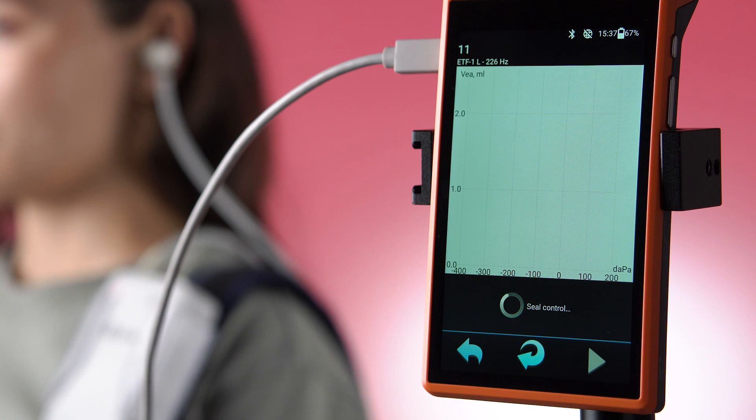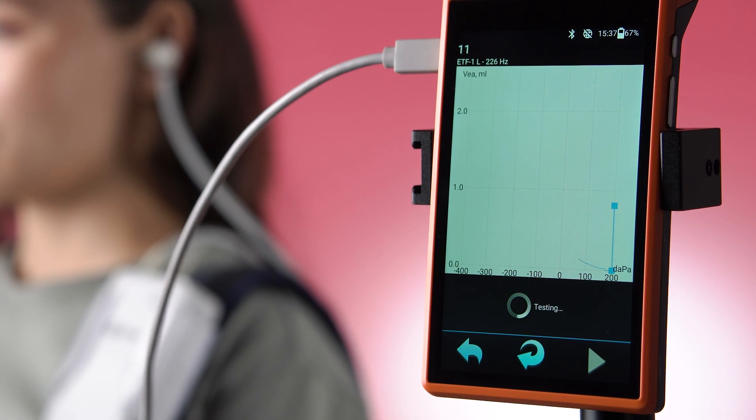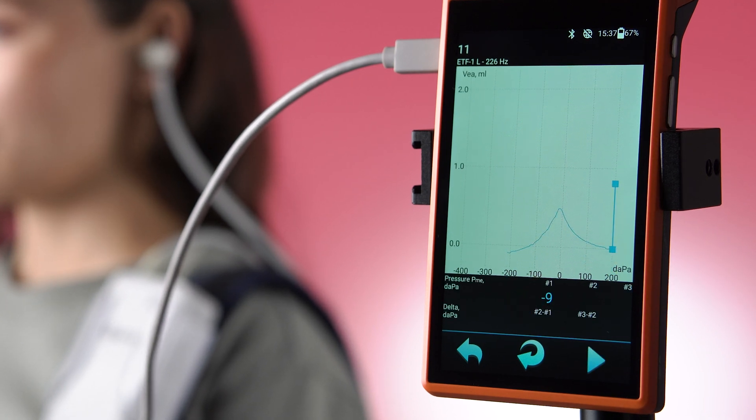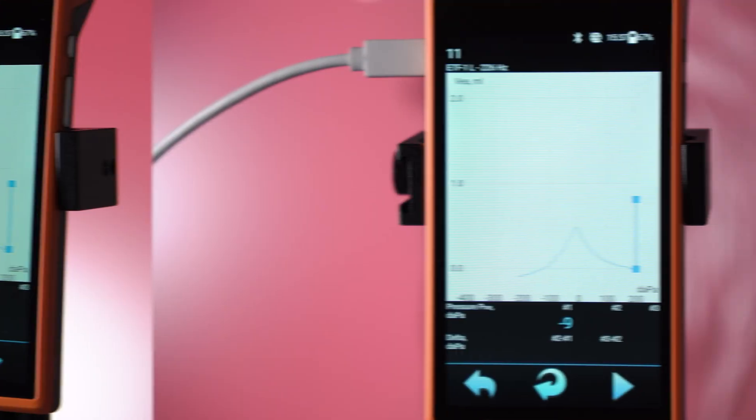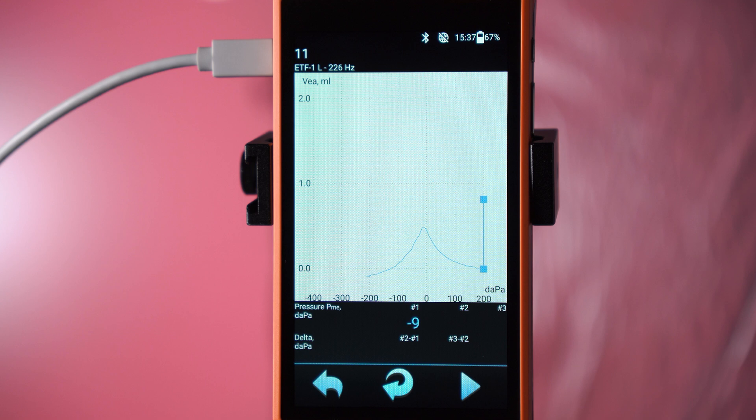At the start of the examination, a seal control will appear on the screen. If the ear tip is selected in the wrong size and there is a leakage, or if the ear tip rests against the wall of the external ear canal, the test will be automatically paused.